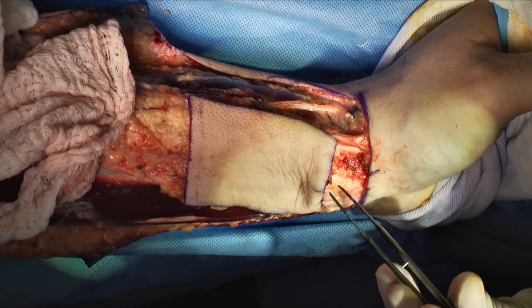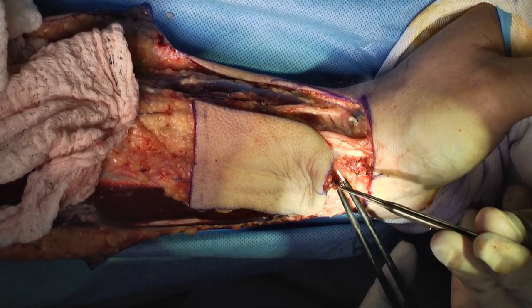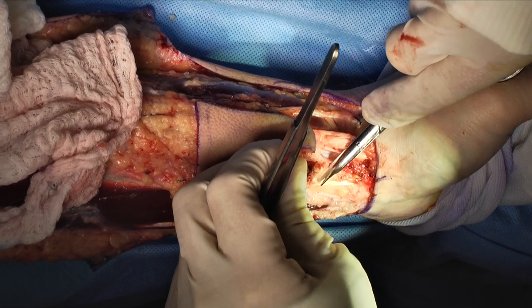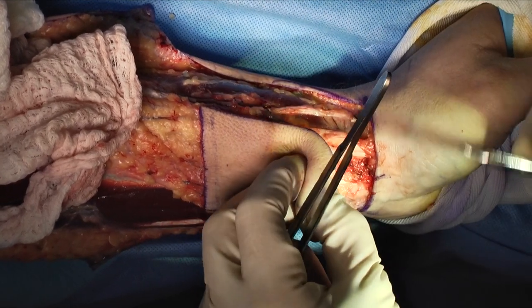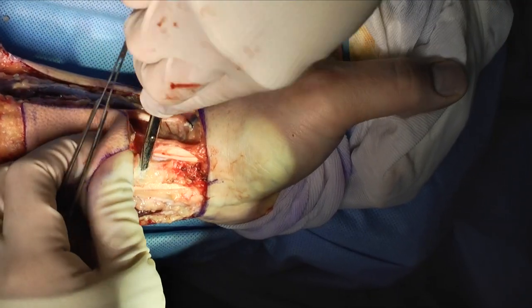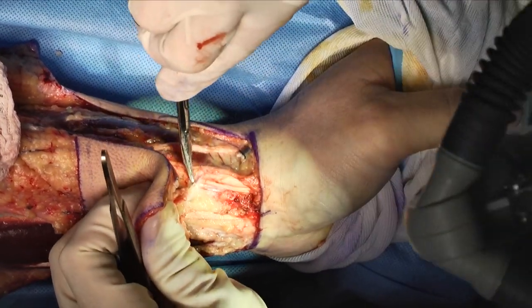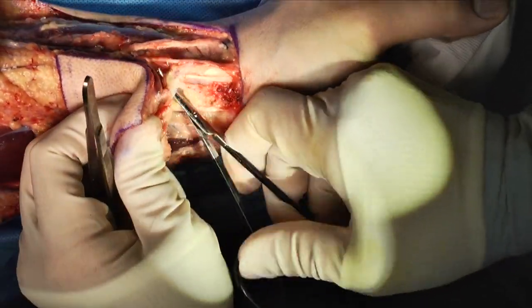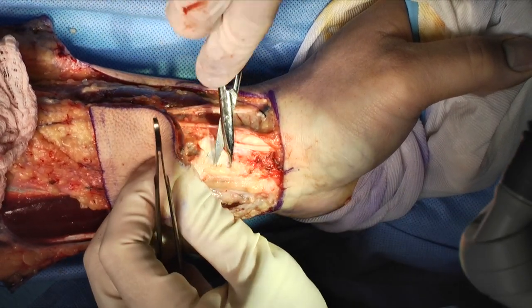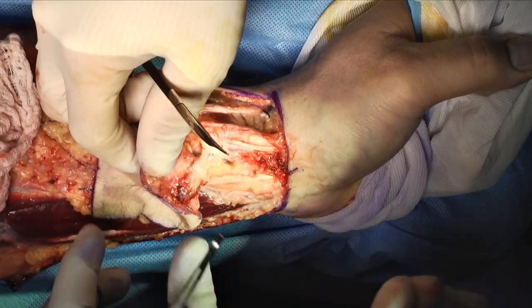After tying the artery, which you can see here gripped with the forceps, we begin dissecting distally to proximally, transecting or cauterizing deeper branches that supply the muscles of the forearm and the radius. This dissection is continued, with smaller vessels being bipolar cauterized and some of the deeper vessels being either clipped or tied.